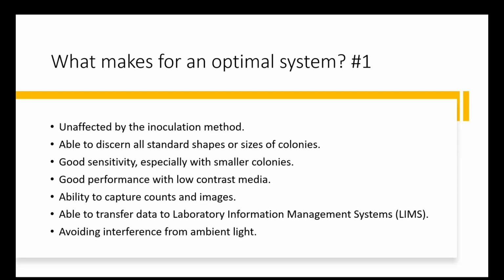So there are some clear advantages to consider automated colony counters, and there are different technologies available on the market.